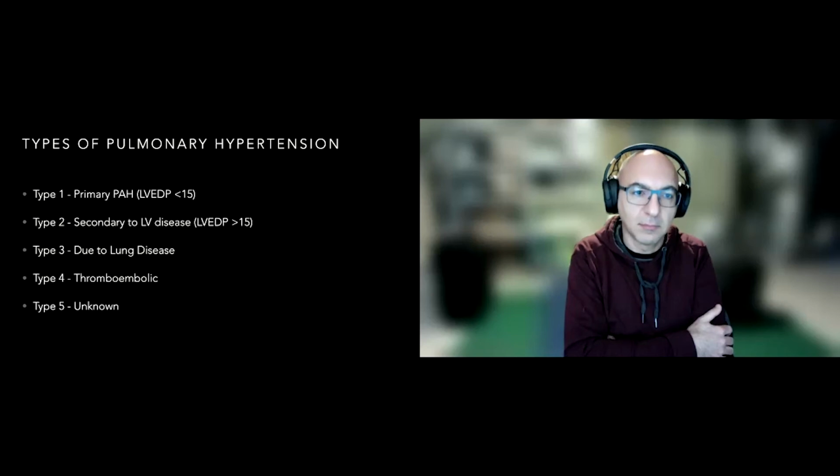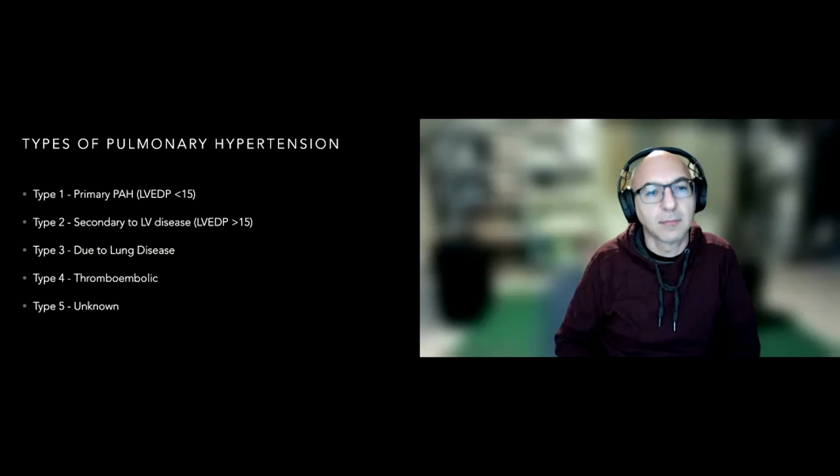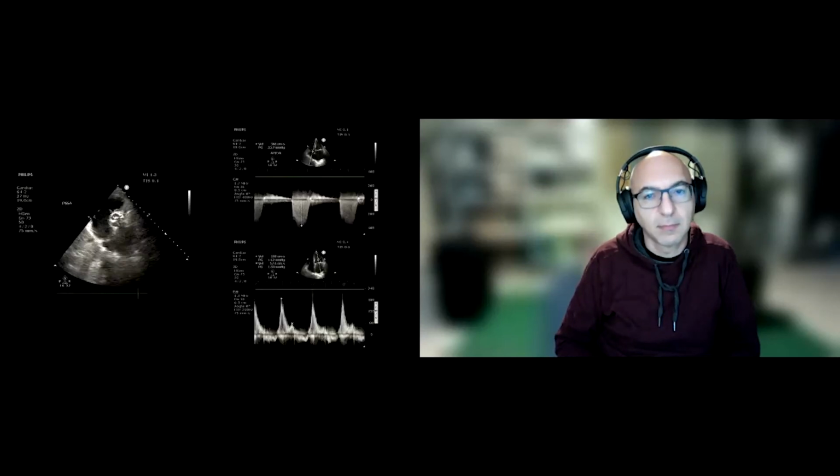And without getting into the nuances of all that, one of the reasons it's helpful to know this is basically to say, look, an isolated view of pulmonary hypertension is helpful to some degree, but you have to put it in the context of the rest of the cardiopulmonary picture to really fully understand what's going on with the patient, what you need to do. You can't just measure it, high five yourself, like, wow, that felt cool, I did something advanced, without fully understanding what the loading conditions on the lung are, because obviously the management is going to nuance itself out in very different ways down the line. But with that said, I'm going to flip over here, just a summary picture. All right.